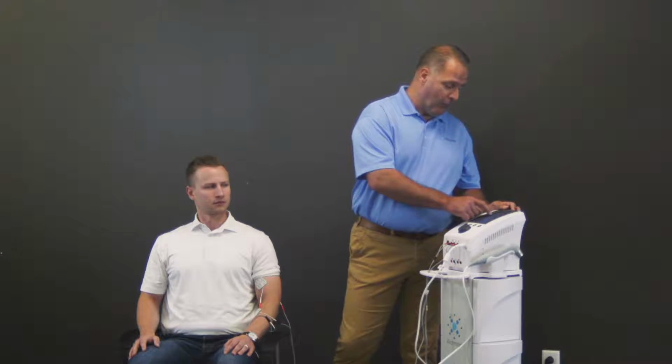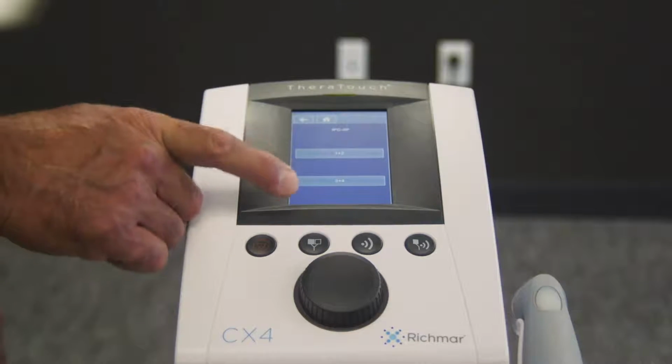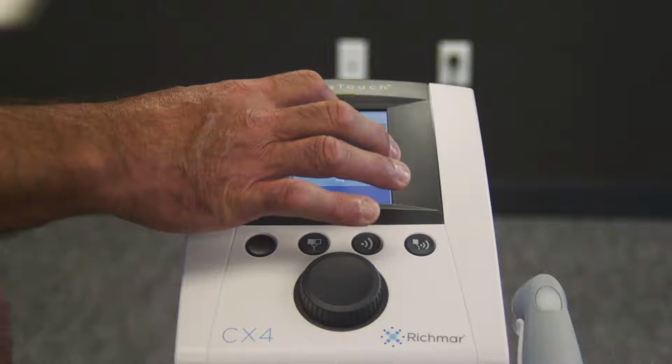So when you look at your device, you'll go to your interferential waveform. You have to pick between channels 1 and 2 or 3 and 4 because true interferential needs two sets of lead wires. One of the features you want to look at is the carrier frequency option on your device. Some have just a standard set frequency of 4,000 hertz, where others have some variability. Some may only go from 4,000 to 5,000 hertz, where others will go all the way up to 10,000 hertz, which effectively creates a different effect called the Wadinsky protocol.